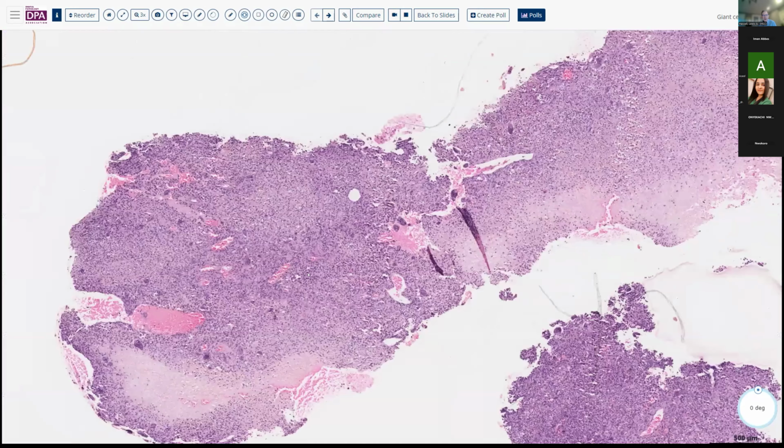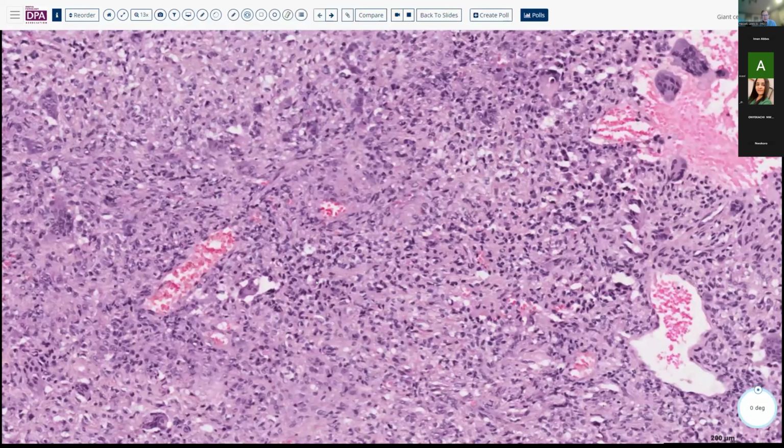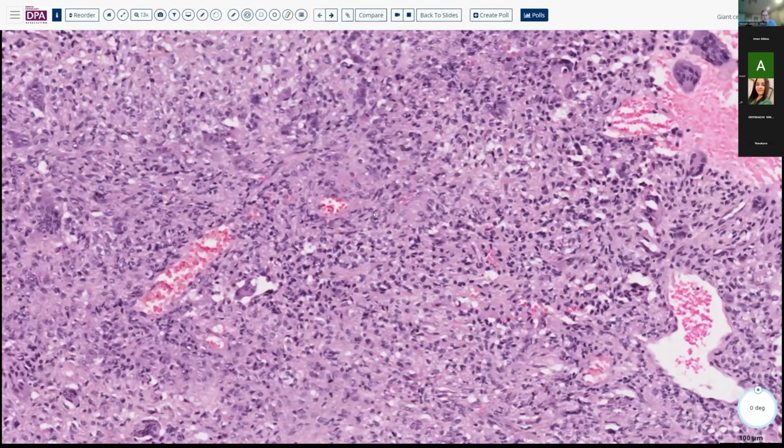So in terms of mitotic activity, we don't see a lot of mitotic activity. We don't see a high degree of anaplasia that would suggest osteosarcoma. Of course, I'm showing you this without the benefit of the radiograph. And this was done at a time prior to having really much of anything in terms of immunohistochemistry available to us as workup.